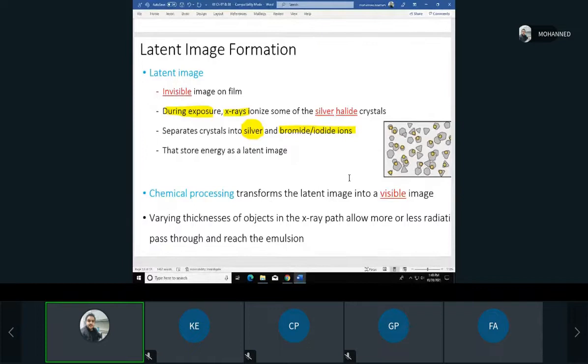While, for example, when the X-ray hits the tooth, it cannot pass through the tooth, and it will not expose these crystals, and then these crystals will not turn dark. Does that make sense? Yes, and that's why the soft tissue parts of the film would appear dark because they would not stop the X-ray, and the X-ray would hit the crystals, and when the crystals are hit, they will turn dark technically.